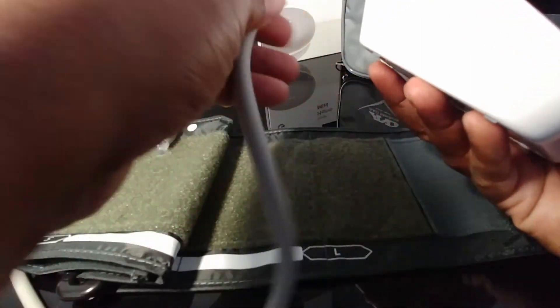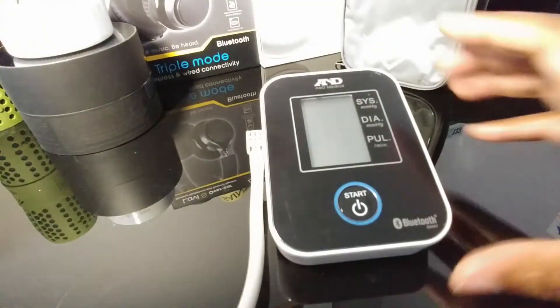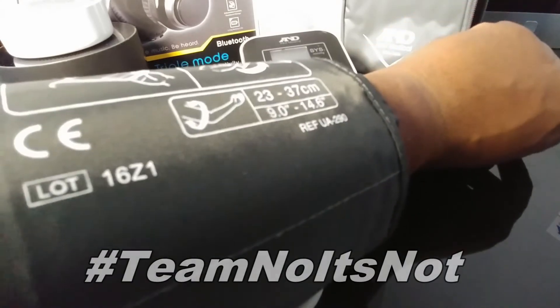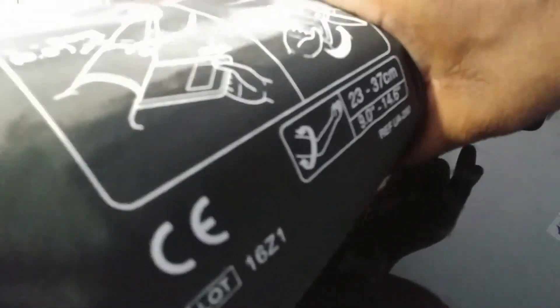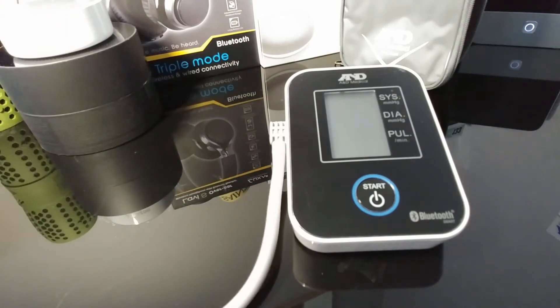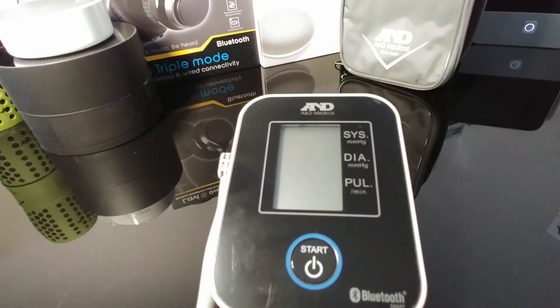We're going to plug the cuff in and go ahead and power it up. All right — this is where you place the cuff on your arm right there. You hit the on button on the unit. You want to make sure you're completely still when this is happening. Let me put my arm down, get closer up on that, and I'm going to be quiet while this thing goes.